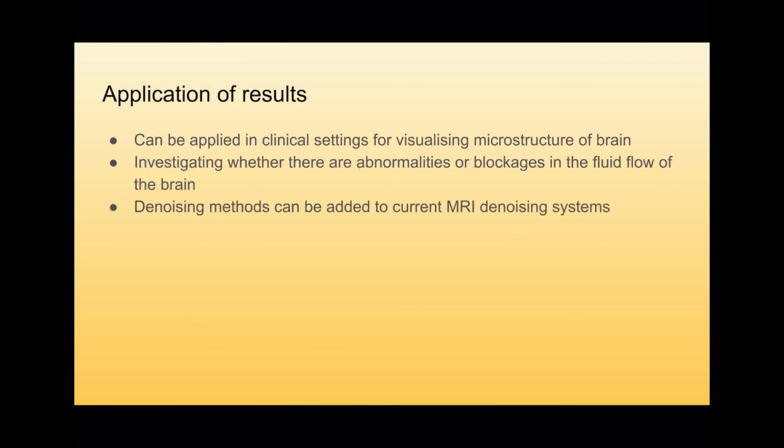The results now can be applied in clinical settings for visualizing the microstructure of the brain and investigating whether there are abnormalities or blockages in the fluid flow of the brain. Also, the denoising methods can be added to current MRI denoising systems.